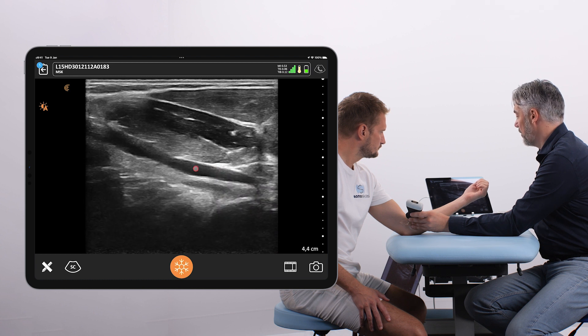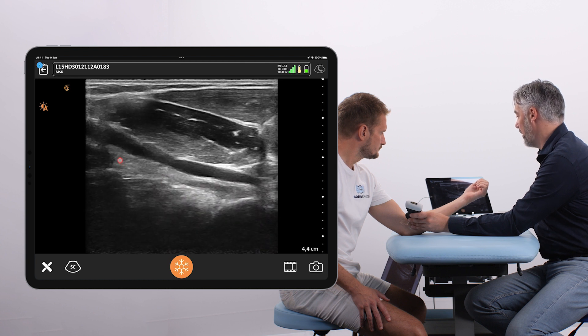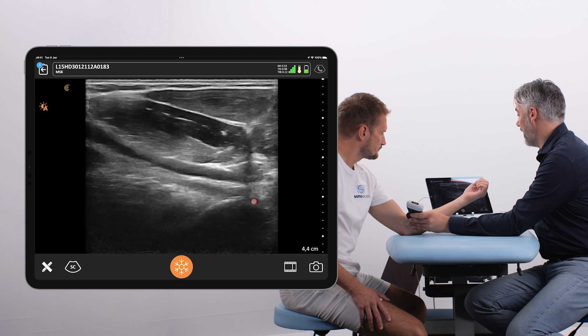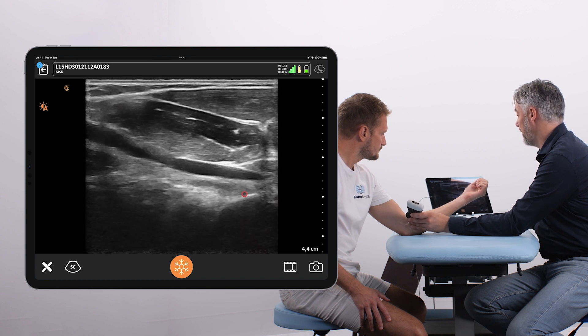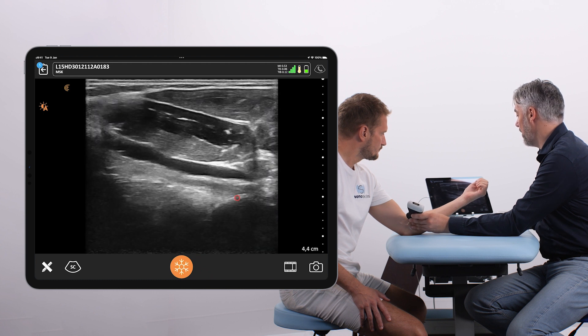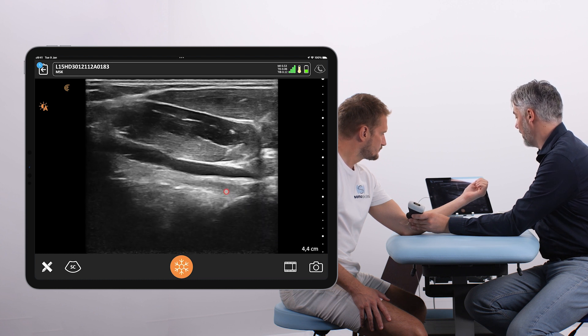The brachial artery is not only an important landmark, but it is also an acoustic window to optimally see the distal bicep tendon. We can now see the whole distal bicep tendon with its full insertion. We scan back and forth to evaluate every part, looking for signs of tearing, fluid accumulations due to bursitis, foreign bodies, or calcifications.